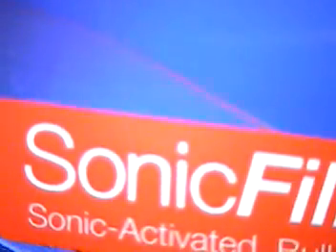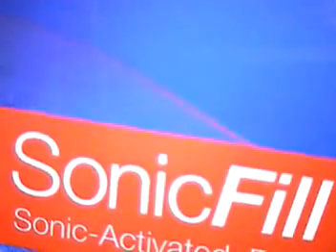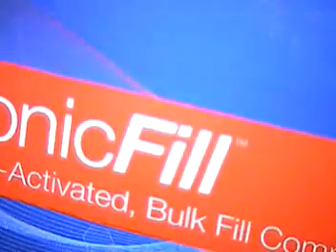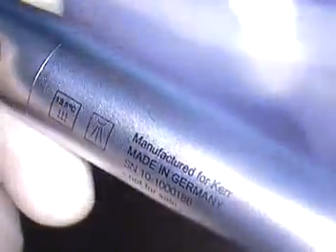Well, hello, this is Dr. Jerry Cuomo. We're going to give you the final filming here just to show everyone in the audience that SonicFill — it's a new product from Kerr, sonic activated, working together in tandem with Kavo, I believe, with the handpiece. We'll show you the handpiece again if you missed it on the first segment. Manufactured for Kerr.